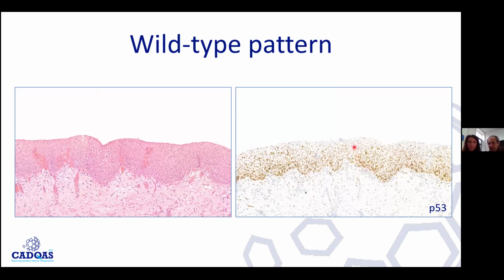But then you see it fading. It varies. There are weakly staining cells and stronger staining cells. I don't think we even see a tiny clone of cells that are alike. So the interpretation of this would be that there is activation of P53. It must be there because maybe the tissue was irradiated, as you said. It is trying to repair.